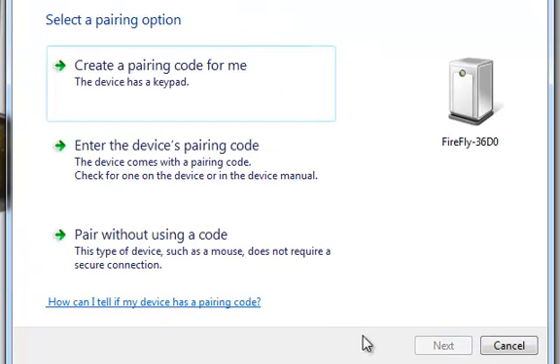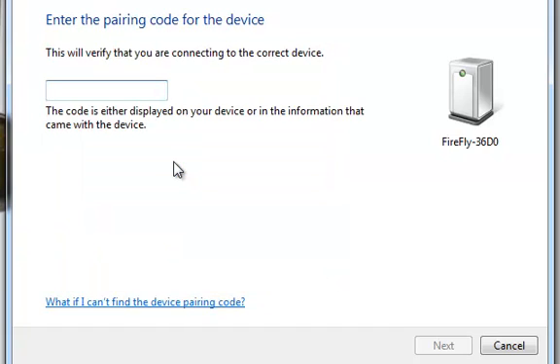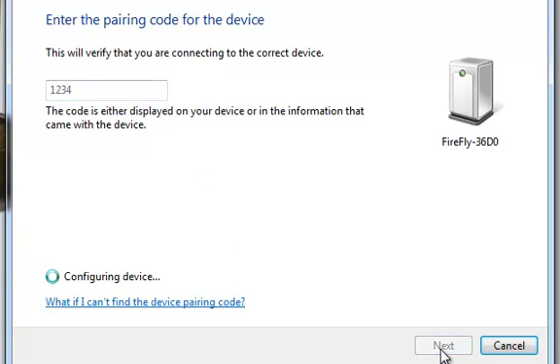I can enter a Bluetooth pairing code of 1234. Windows will install drivers and assign a serial port to allow me to communicate with the device.